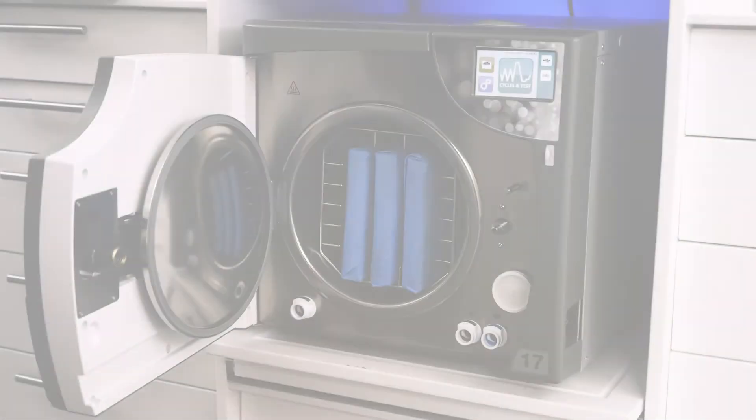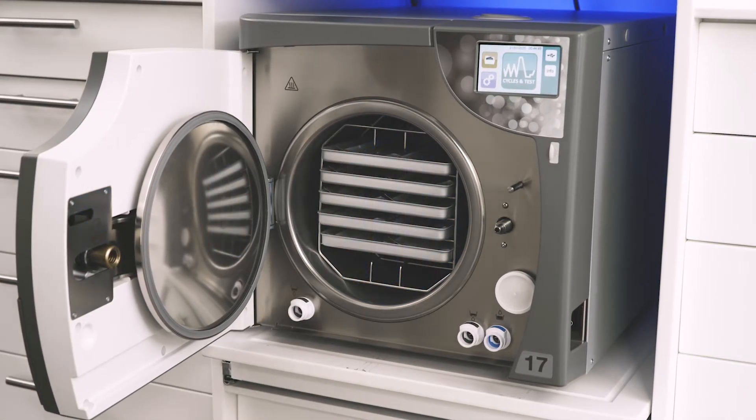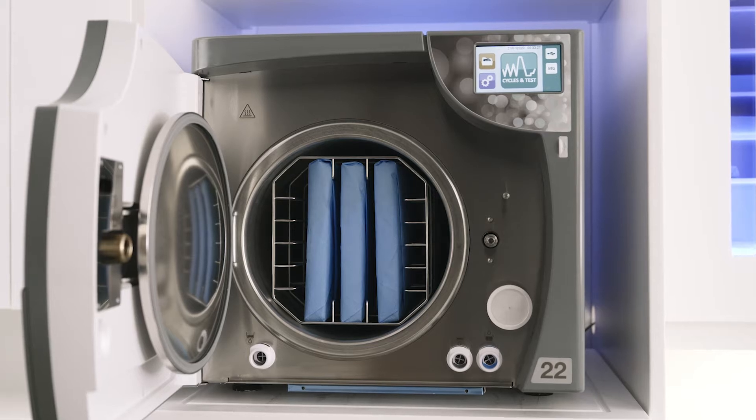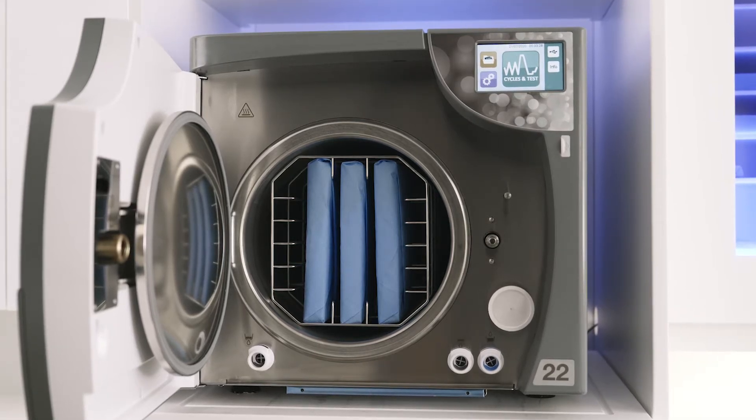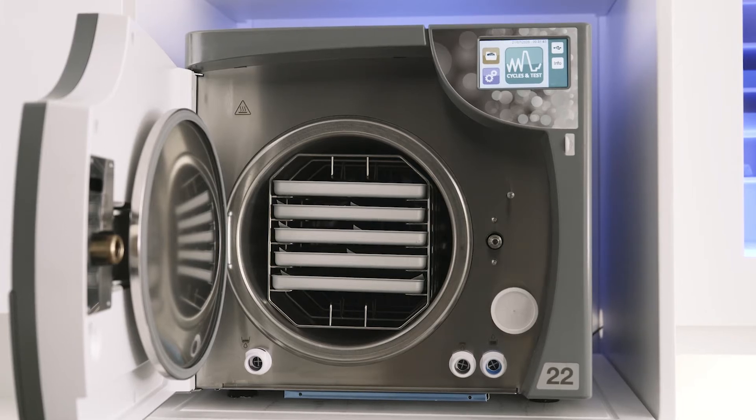The 17-liter can sterilize three full-size cassettes or up to 20 pouches on the five included trays. And the 22-liter, which has a deeper chamber, can sterilize three oral surgery cassettes or up to 25 pouches on the five included trays.